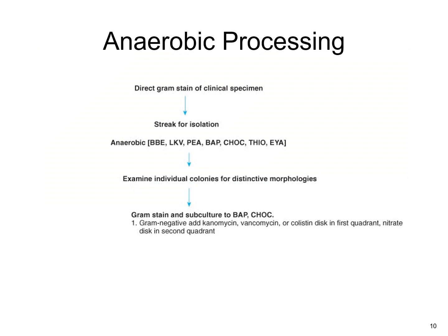When a specimen is submitted for possible anaerobic culture, or if the physician suspects an anaerobe and sends an anaerobic culture, then the sample may be reviewed with a gram stain for a direct testing method. So, for example, if it was an aspirate fluid, then the gram stain would be made of the fluid and reviewed to see if there are any organisms present. And so that would help give a preliminary report.